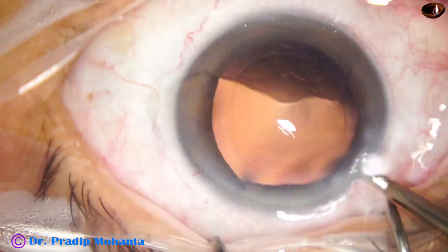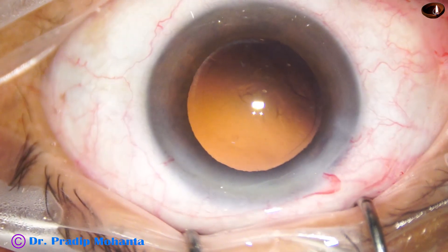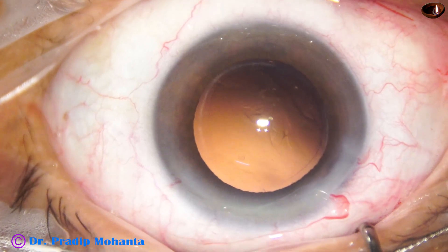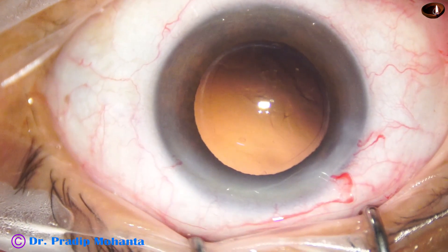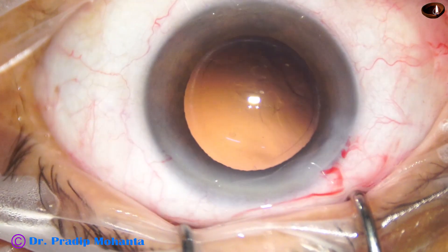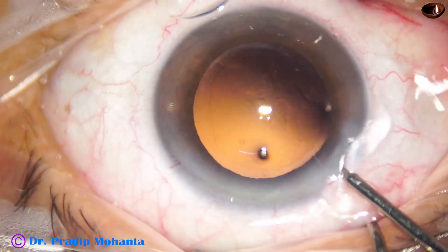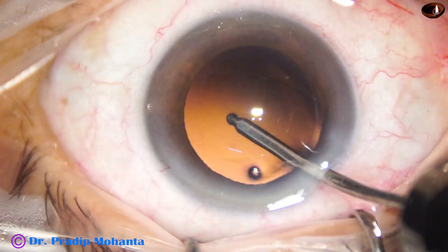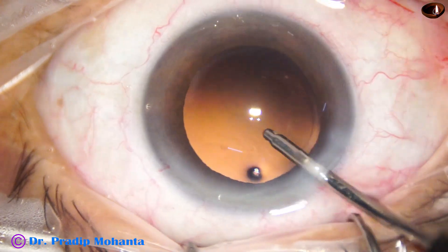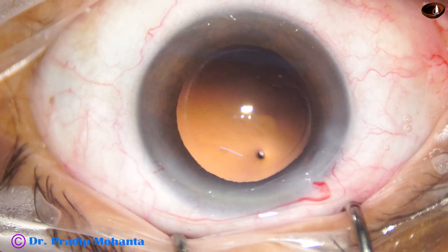The sub-incisional cortex is also removed by the coaxial irrigation-aspiration. Now this is the irrigating probe for polishing the posterior capsule before intraocular lens implantation.